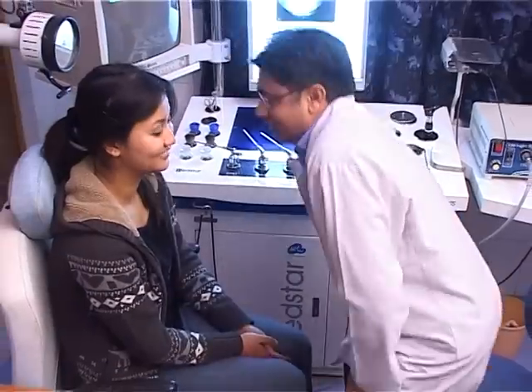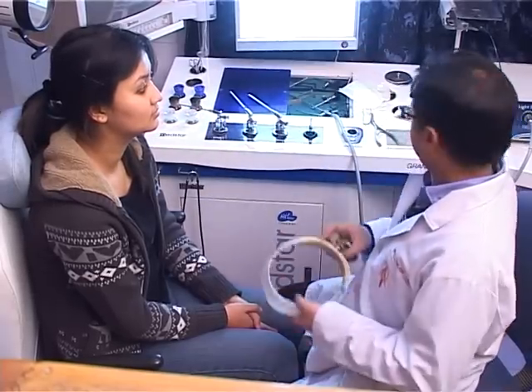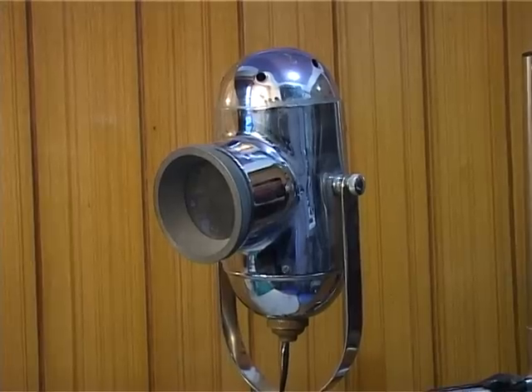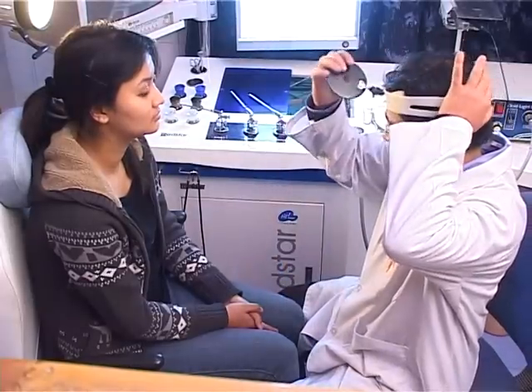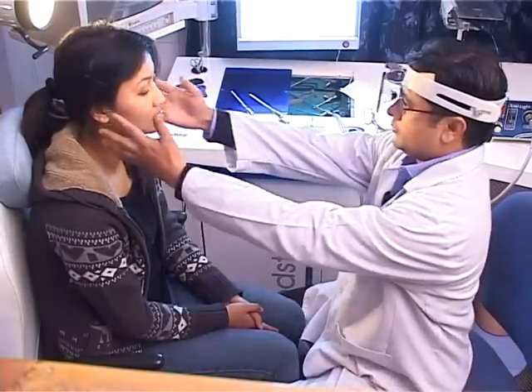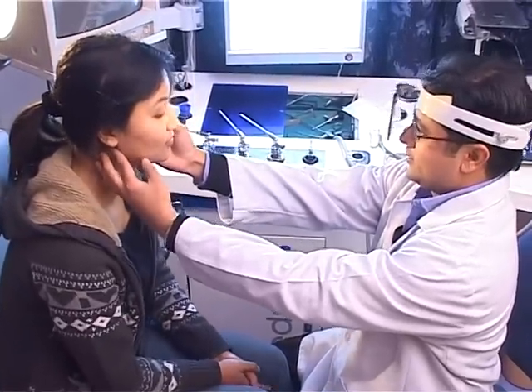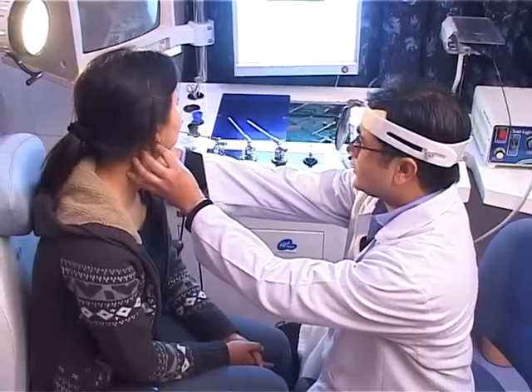The patient and the examiner are seated in a chair no more than 8 inches apart. A bull's eye lamp with a bulb of 70–100 watts and a plano-convex lens is used, placed 6 inches above and behind the left shoulder of the patient at the level of his or her ear.